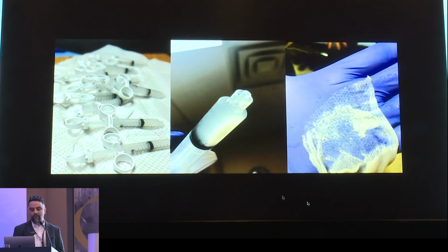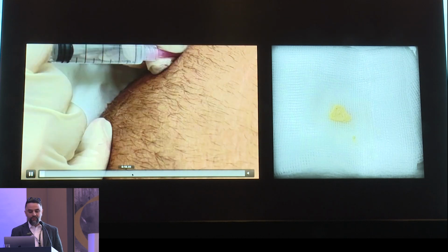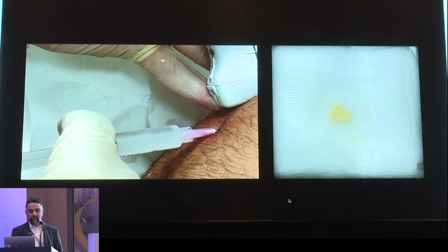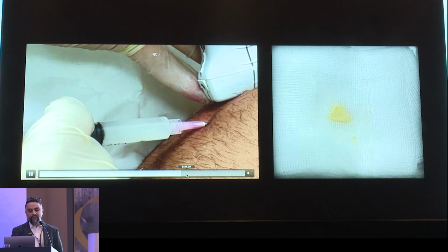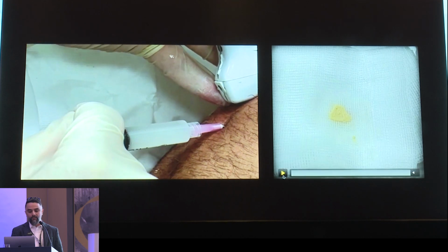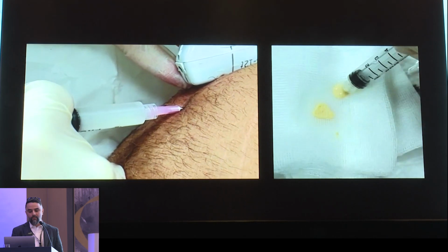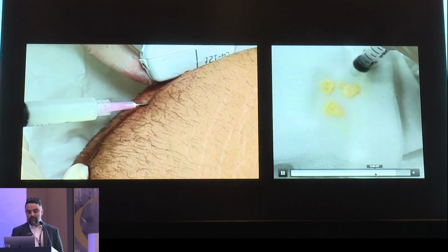So that was one of the largest cases. We took a lot of calcium out, and you can see the resorptive and cloudy appearance of the liquid here. That's another case with a very large amount of calcium taken out, and it's a one needle technique again. So this is one of the biggest calcifications. It's very satisfying when you see those.